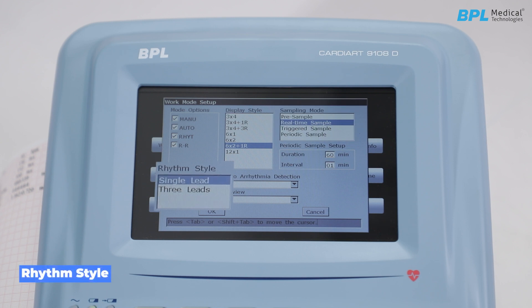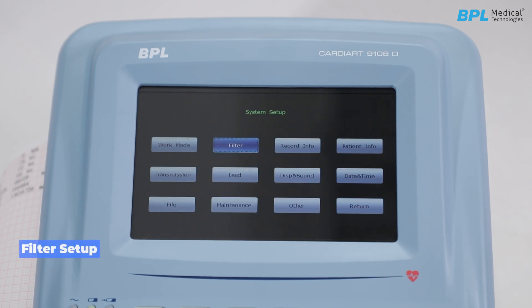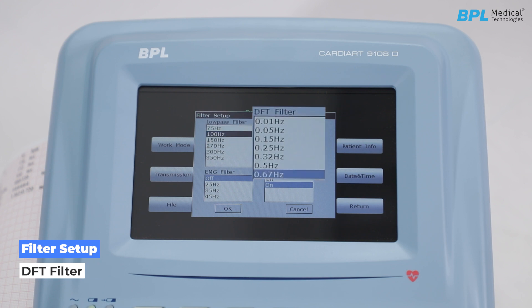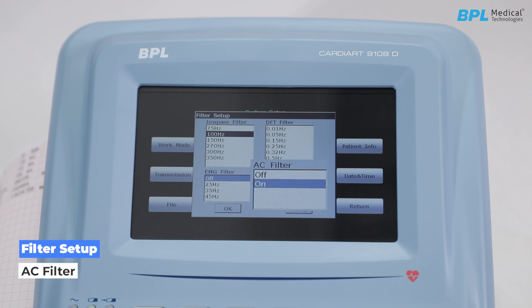For rhythm style, there are two options: single lead and three lead. Auto-arrhythmia detection can be turned on or off. Preview can be enabled or disabled — if enabled, you can view the screen before printing. For filter setup: the low-pass filter restricts the bandwidth of the input signal; the DFT filter reduces baseline fluctuations; the EMG filter suppresses disturbance caused by strong muscle tremor; and the AC filter can be enabled or disabled, mainly to reduce noise and interference.